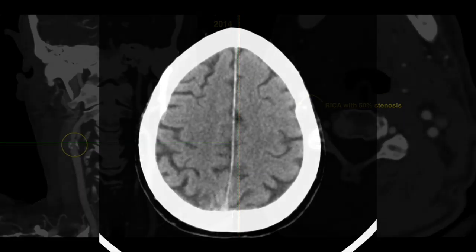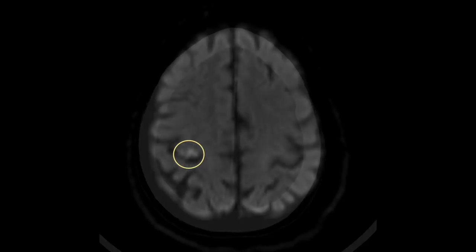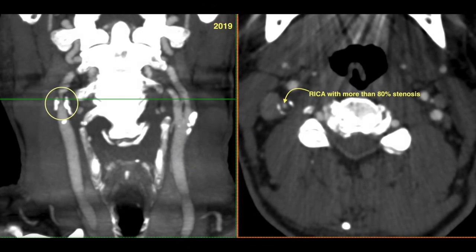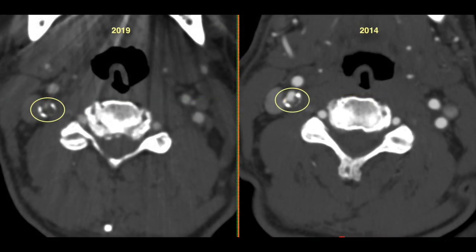You just saw the 2014 CTA, and then he had this diffusion hit on MR with a negative CT scan. This was his follow-up CTA showing a much more severe narrowing up to 80%. On the axial views you can compare left versus right, and the 2019 versus 2014 study, showing progression of the disease.